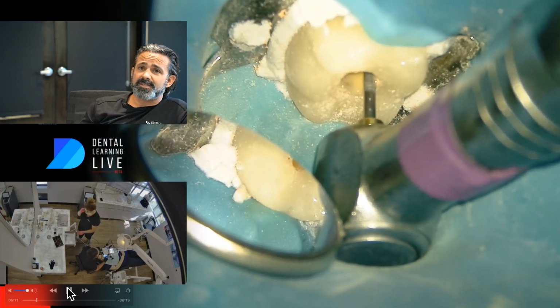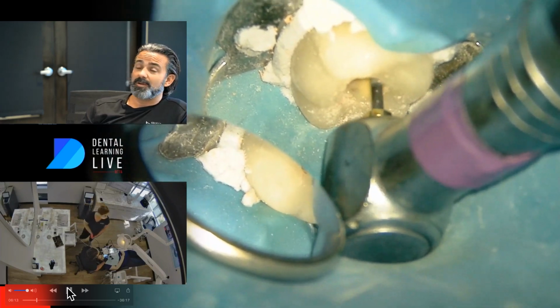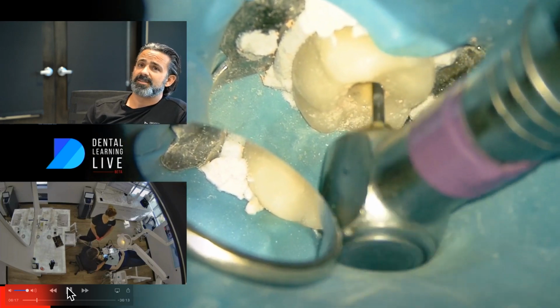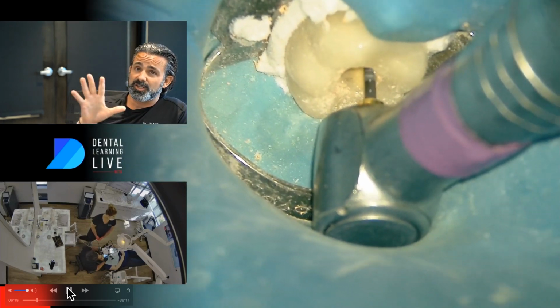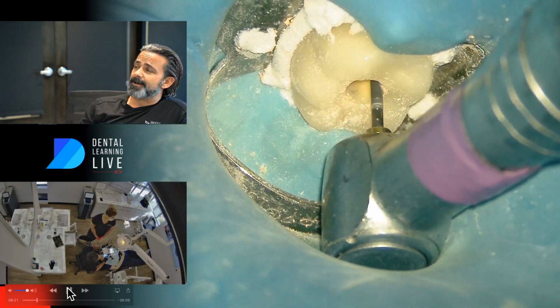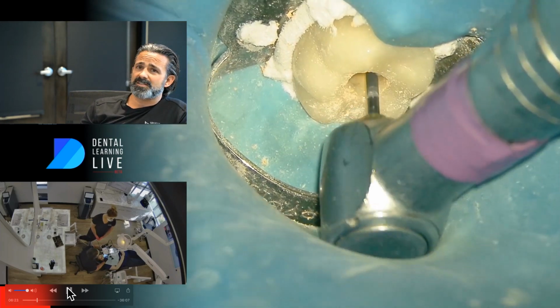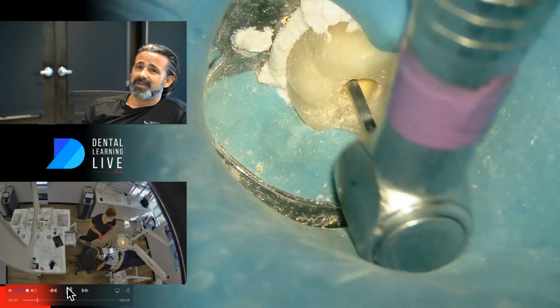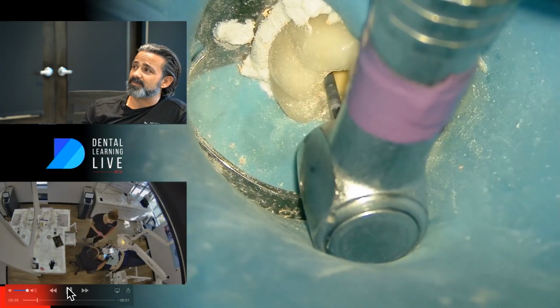Now the other thing is I don't want to go long, so I don't want to push anything out. I've got to be careful of that. And so the softer I make this, the safer it is in an extrusion setting. And I don't want to necessarily enlarge it physically. I just want to clean it. And so that's what I'm going to be relying on some fluid dynamics for.